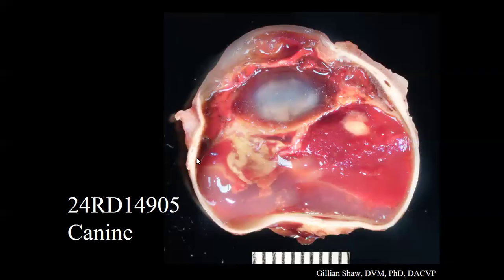So we received the globe, and it's kind of a hot mess inside, but basically there's a lot of hemorrhage. So we have hemorrhage and some sort of tan material in the anterior chamber, kind of lining up along the iris surfaces. It's surrounding the lens. The retina is a little bit hard to identify. This is actually the second half of the eye because I looked at the slide and thought, wow, we really need a gross picture of this case. So I imagine the retina is up here somewhere because it is detached.